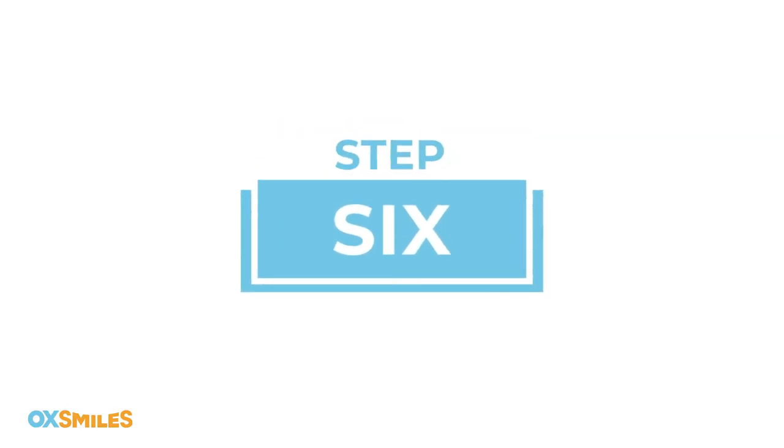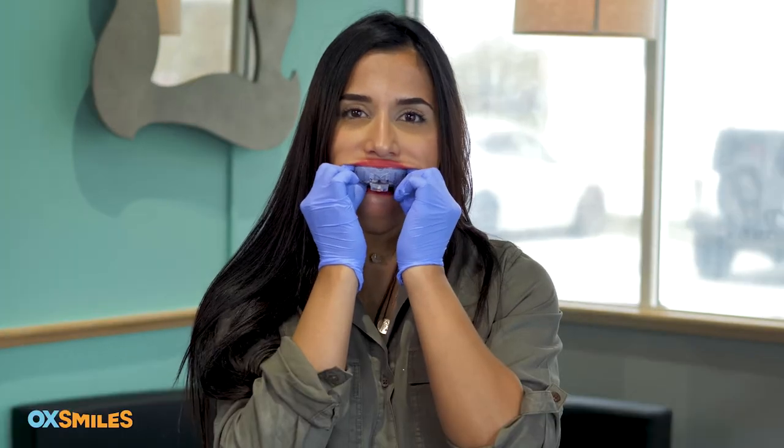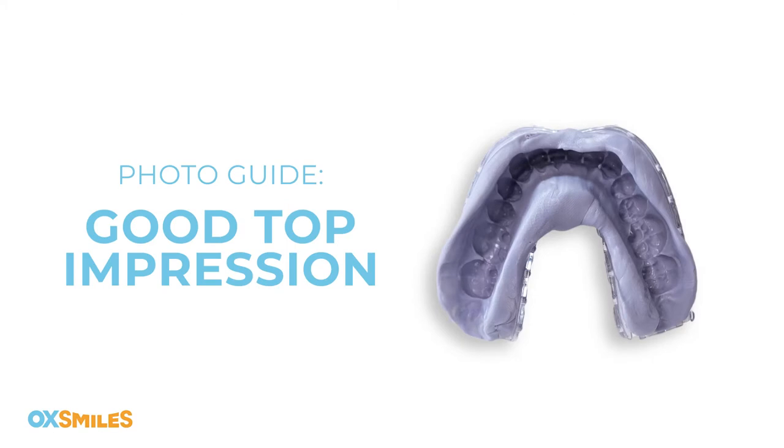Step six: when the timer goes off, you can remove the tray. Push out from the back and use the tab to gently remove the tray from your mouth. Step seven: compare your impression to the photo in the guide.